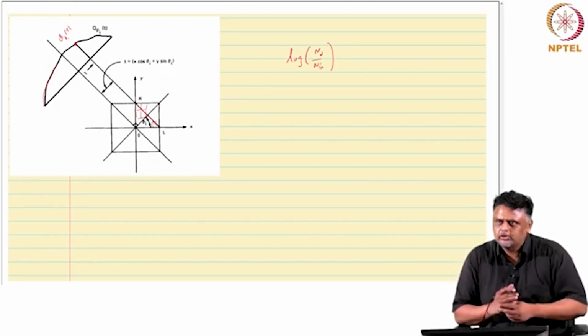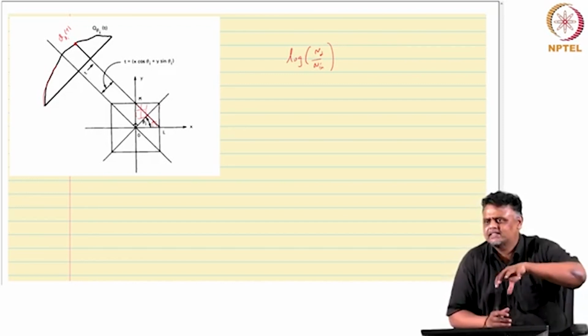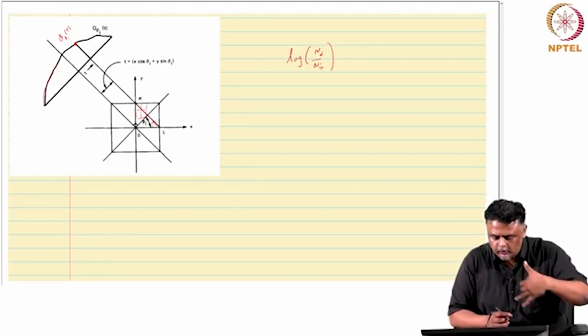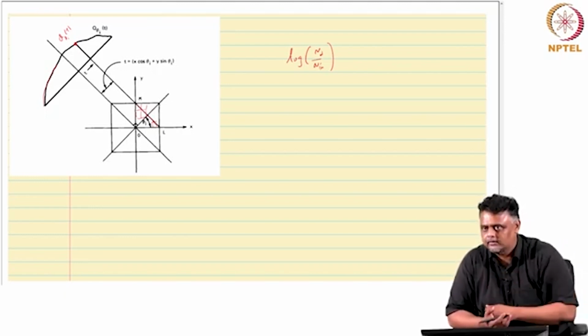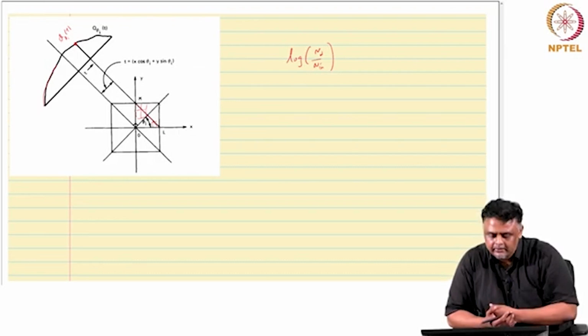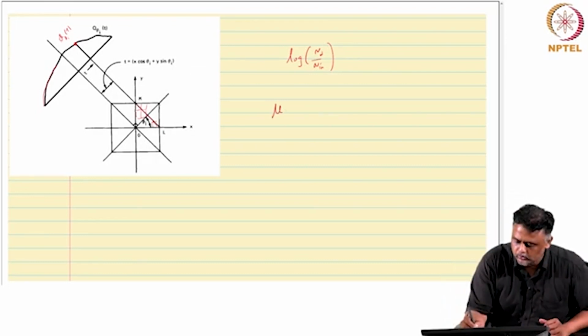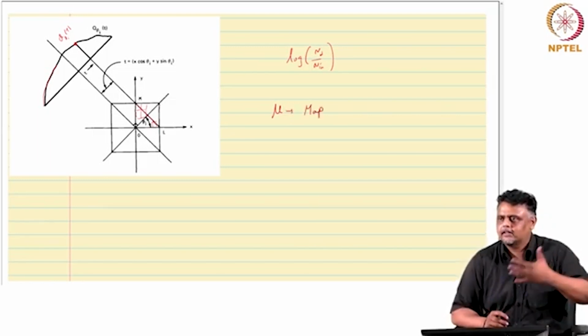Almost any method, except for the deep learning techniques, will have this step somewhere, where you do this smearing or back projection. Once you have done this for every angle and every point on the projection, what are you reconstructing? You are reconstructing the map of mu for a certain cross section.